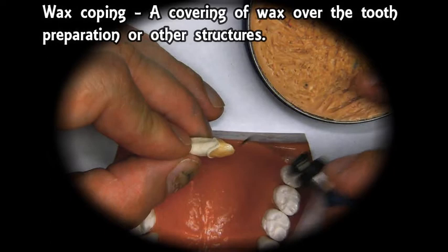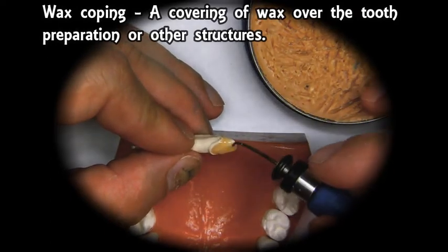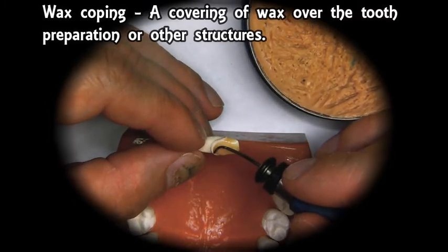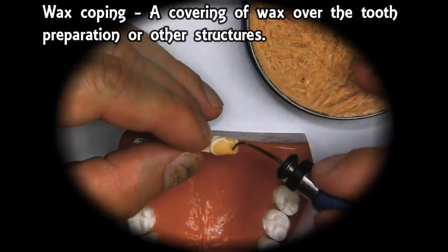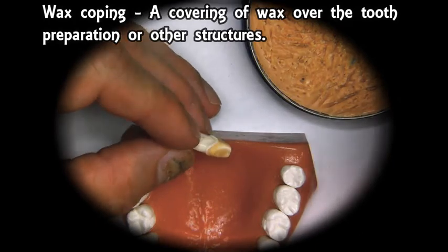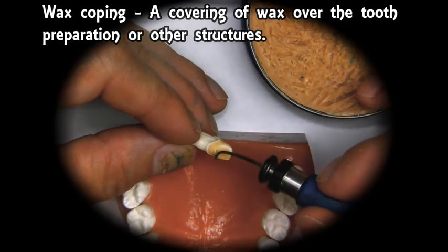We don't want to put too thin of a coat on it, because then we'll just have to add more later. So we just fill this up with wax. In areas where it's very thin, we can add a little bit more.